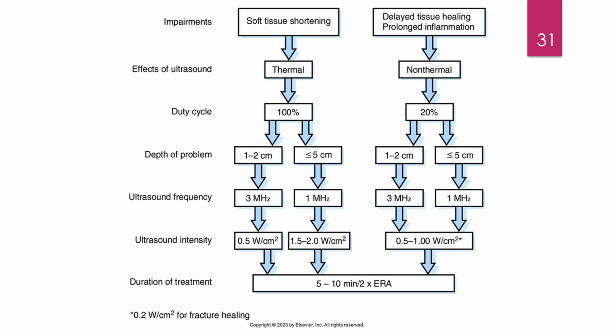The easy way to think about it, again, is if you are going deep into the tissue, you need to increase the intensity. I think the intensity is the hardest parameter for students to remember. Not so much the duty cycle, not so much the frequency, but once they get to the intensity, you can see them start to sweat a little bit. So if it's deep tissue, you're going to increase the intensity, especially if you're trying to initiate more of a heating response.